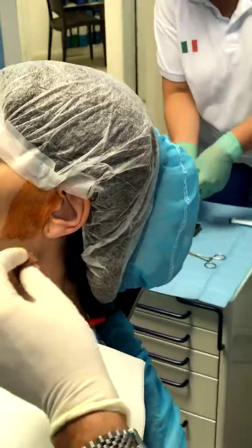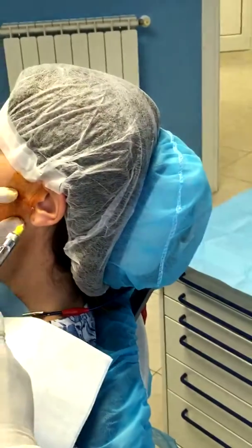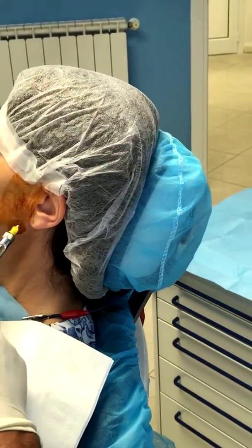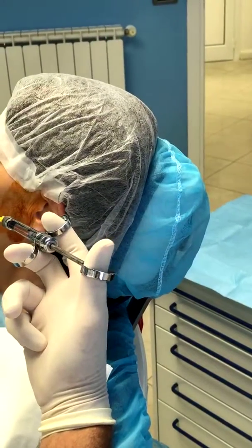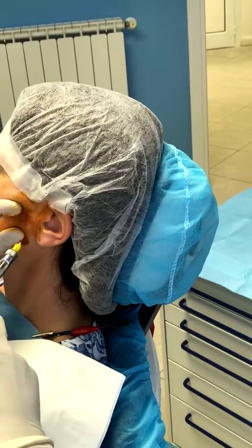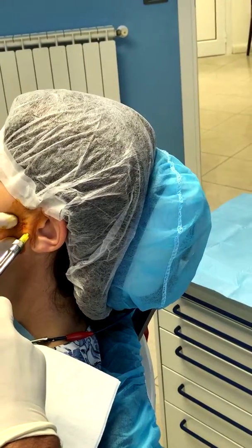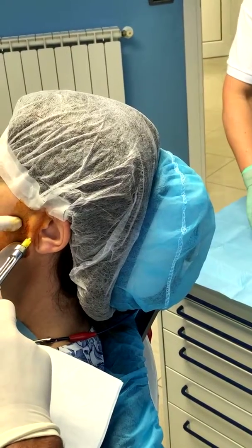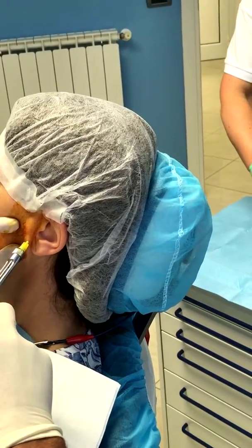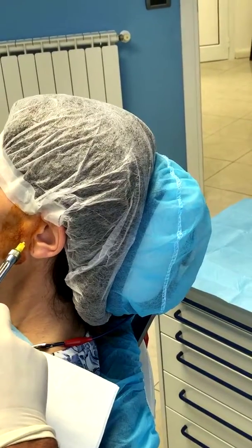So you start from this, you go from here, from the bottom, because if you go straight it's painful for the patient. So you go like this, and she doesn't feel anything. Otherwise if you go straight into the joint, it's painful.